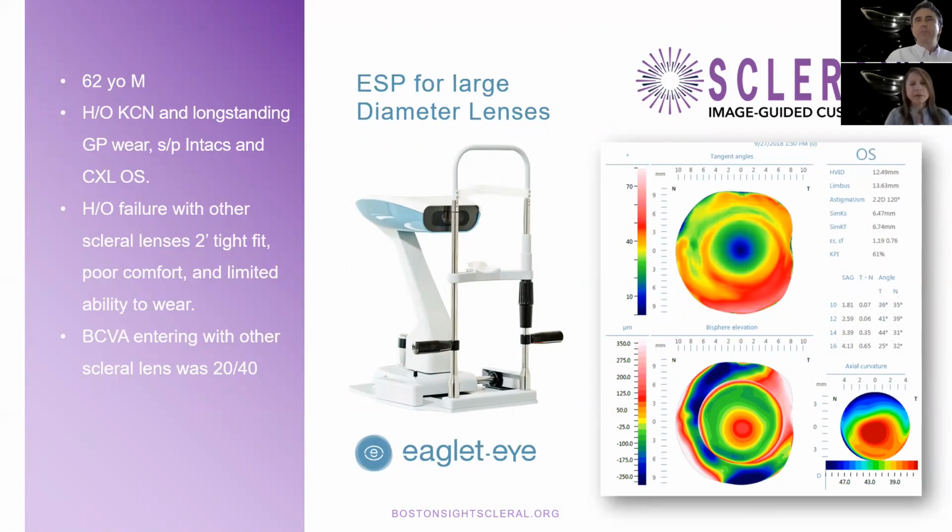But the left eye was more involved, status post intacs and cross-linking, and he was fitted with a scleral lens prior to being seen by us. But the problem with that eye is that he had difficulty with his previous scleral lens and had intolerance secondary to a tight fit, which resulted in poor comfort. That lens, by the way, was actually a smaller diameter lens. And the vision, by the way, was 20/40.